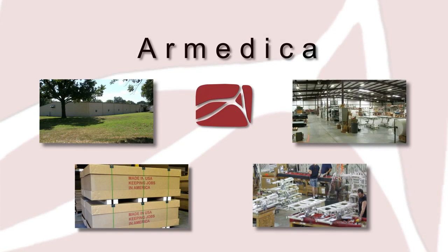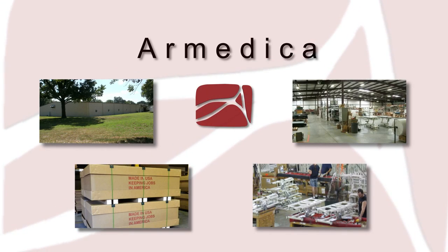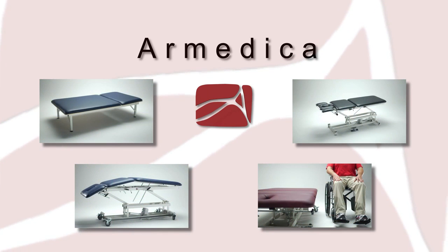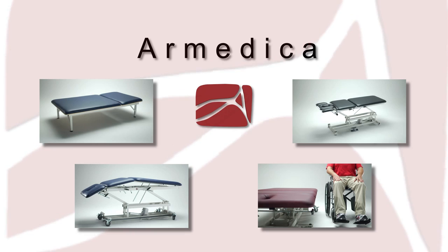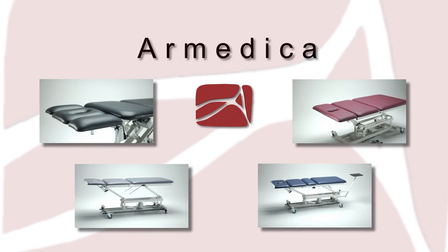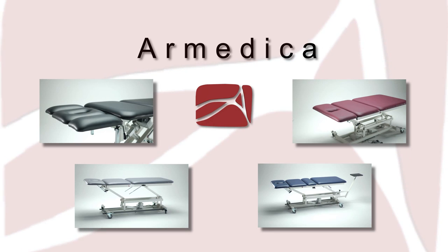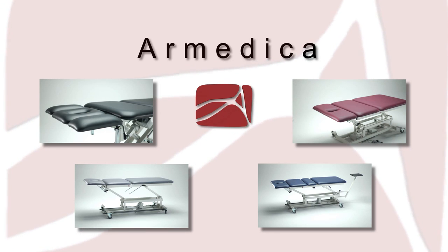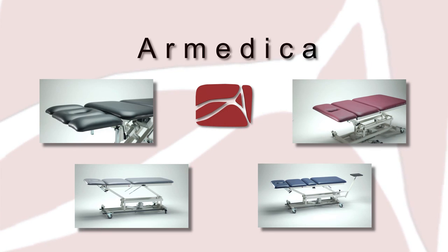All Armedica tables are designed and built in our factory, right here in the USA. Armedica has been manufacturing treatment tables and other physical medicine products for over 16 years. When you select an Armedica table, you'll be part of a growing number of therapists who want a better option for a reliable, durable, and treatment-enhancing high-low table.